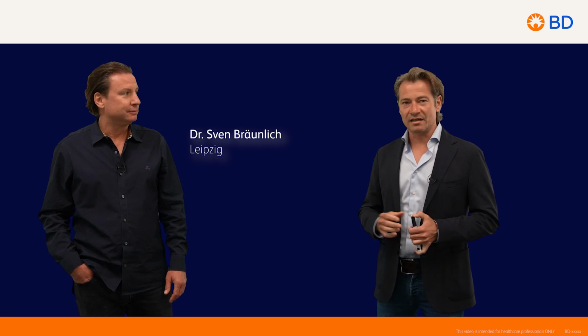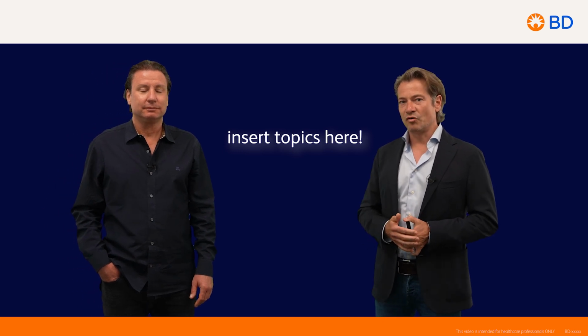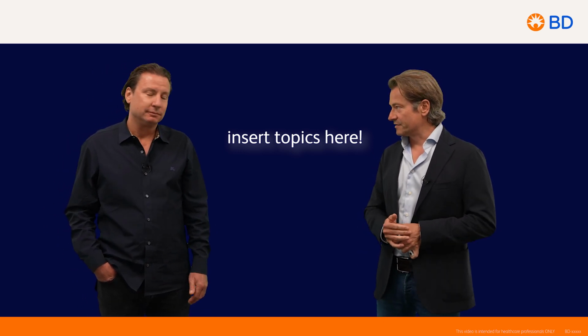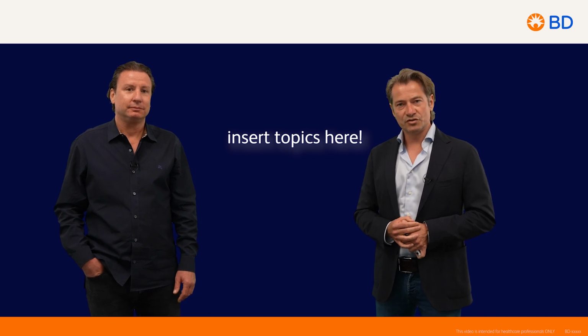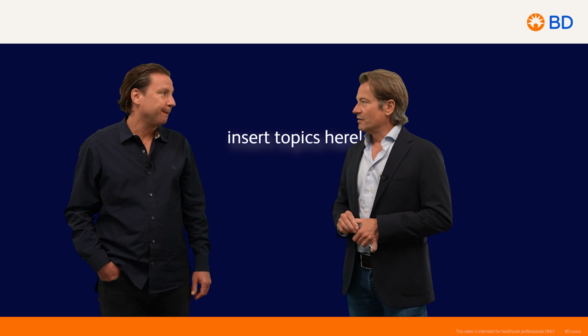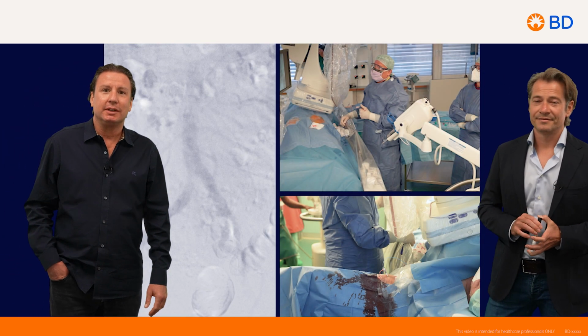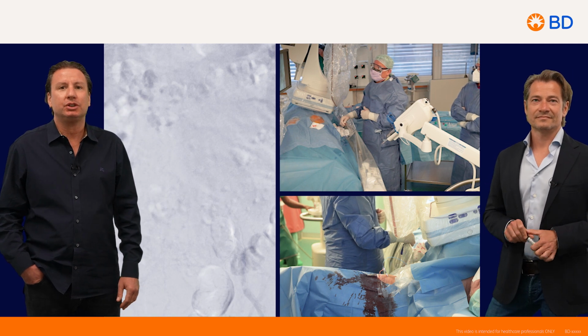Both of us are interventional angiologists with a focus on peripheral interventions in the iliac, FEMPOP and BTK segment. We prepared a case for you with an iliac lesion and SFA lesion, and Sven will introduce you into the case. Thank you, Matthias. We have here a 62-year-old male patient.